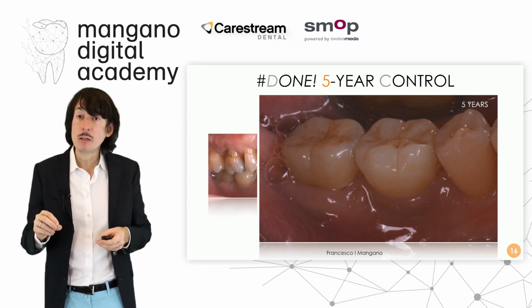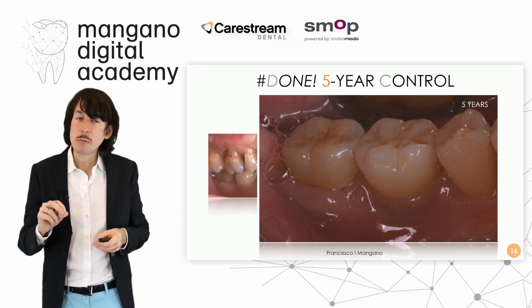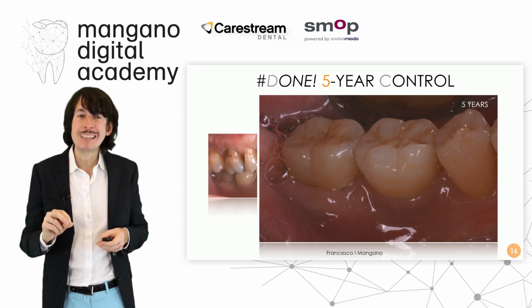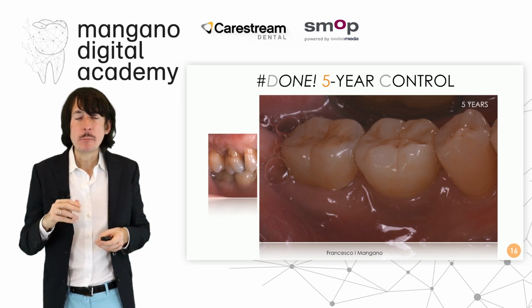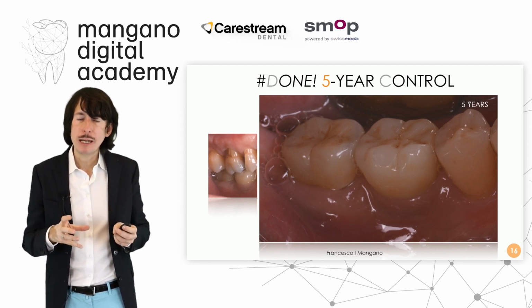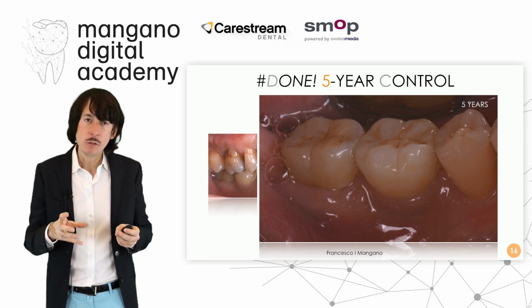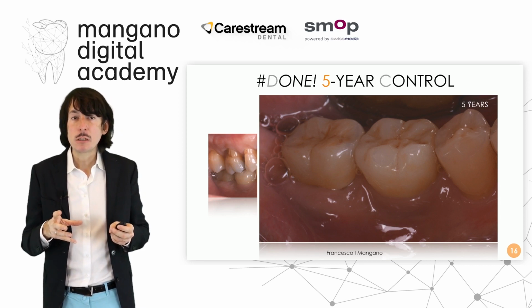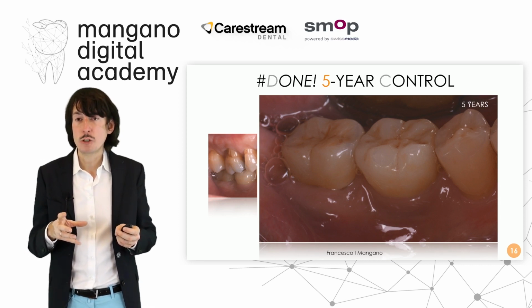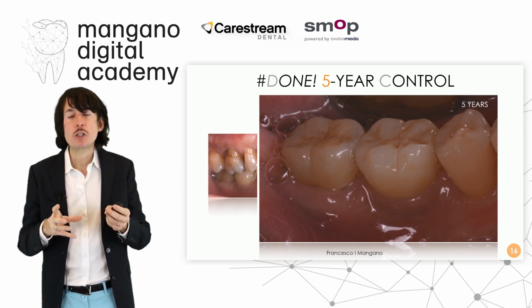The very nice thing with zirconia particularly is that the soft tissue loves zirconia restoration, and this is why in particular I love to use individual hybrid abutment in all cases, also in the posterior. I don't like a crown like a superstructure that closes exactly on the titanium base, because it is more difficult with such a superstructure to work well and to design well the emergence profile.